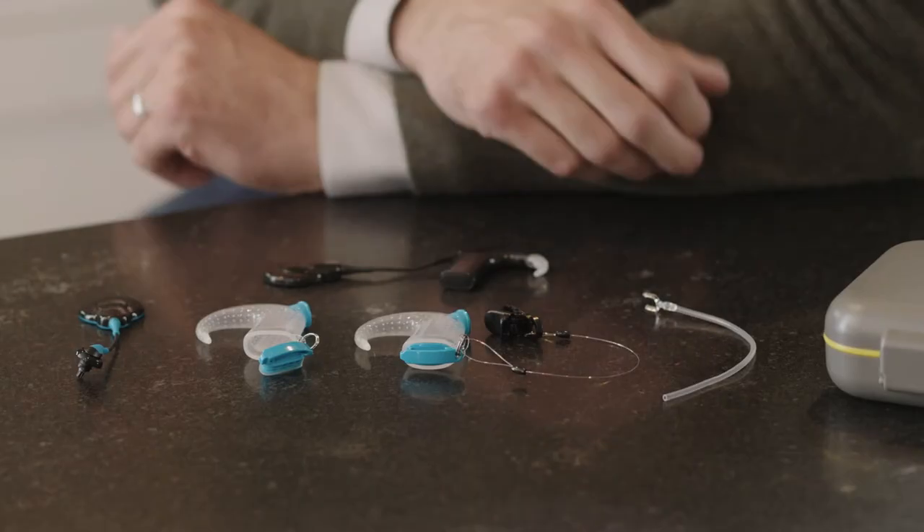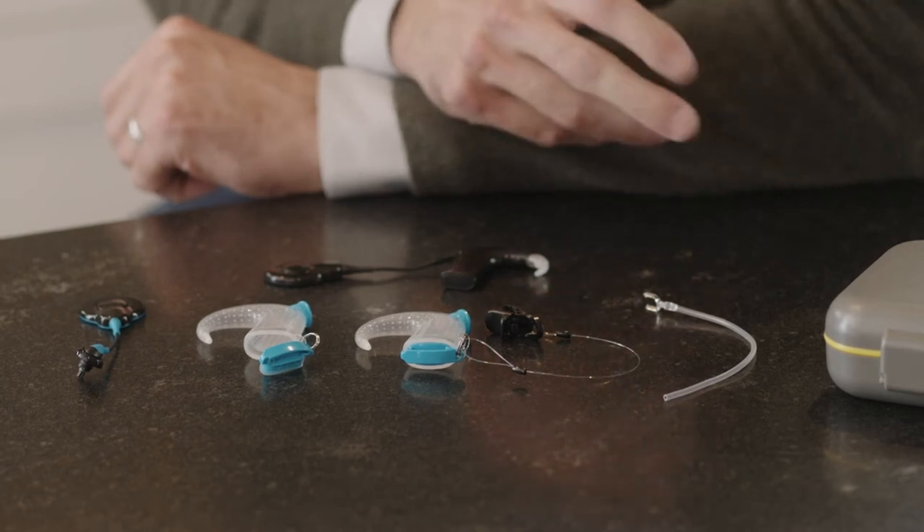If you lead an active lifestyle or like to be in or around water, the Cochlear Nucleus 7 Activity Kit has everything you need. For prolonged water use, Cochlear recommends the Nucleus Aqua Plus for the Cochlear Nucleus 7 sound processor when used with rechargeable batteries to make it waterproof.